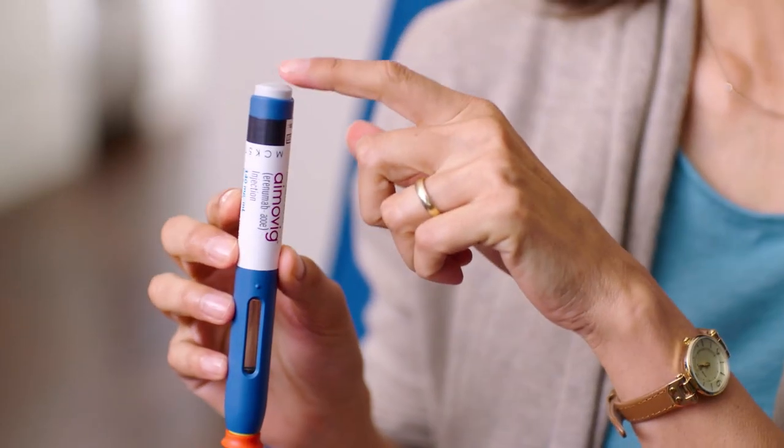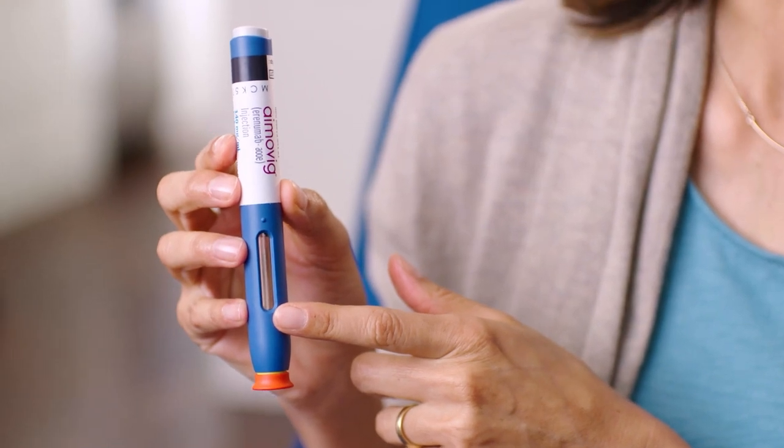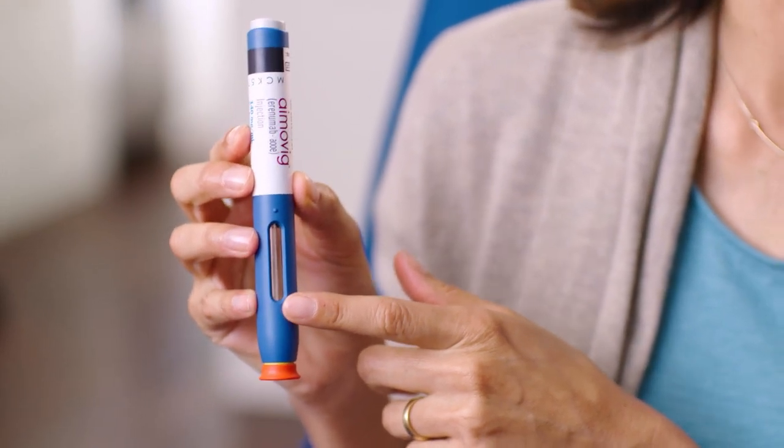See this big start button? You can't miss it. It tells me this is the top of the auto-injector and this is the bottom. And this window — it lets me know when my injection is done, which is why I don't take my eyes off of it until I see a bright yellow window. But more on that later.